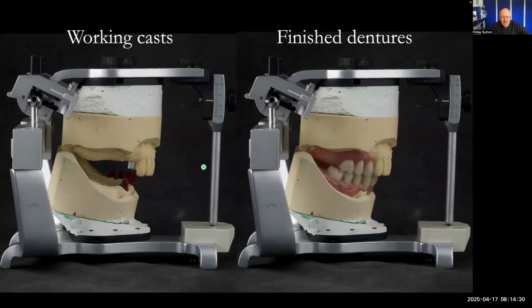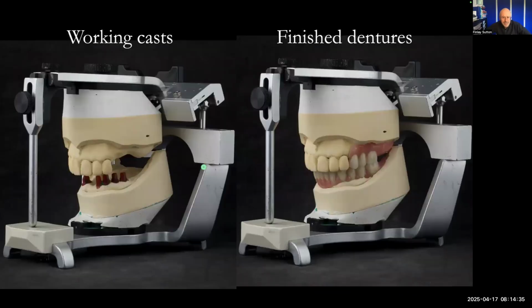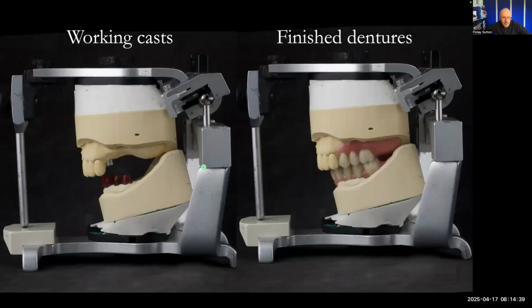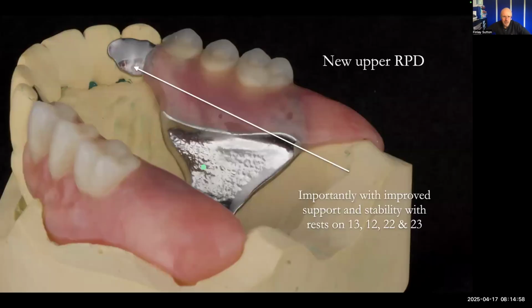Finishes the upper teeth and lower teeth. These are all acrylic based, with the acrylic work finished on top. And it was so funny doing this. Whilst it isn't really, it's funny looking back, but it wasn't funny at the time. Rowan hated it because he was so restricted for space, particularly on this lower bridge.